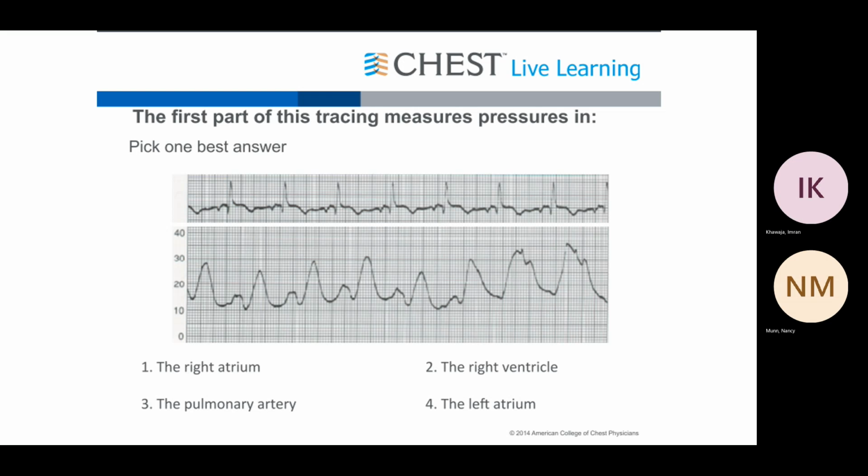And here you have two waveforms, right? Systolic and diastolic. You've got A and V waves, right? So that's the inflated wedge. So the wedge reflects, and from these four answers, what would be the most accurate one?